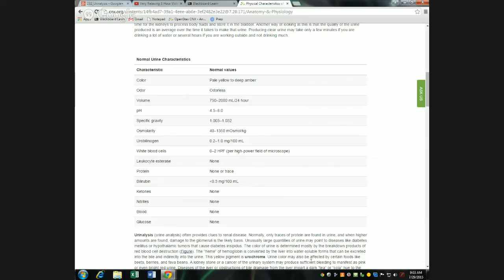But why was it green? Yeah, yellow and blue makes green. It would have been neon blue if she didn't have very dark urine. But the fact that she had some yellow color in the urine, it diluted the blue down and became green. So it could be a different color.